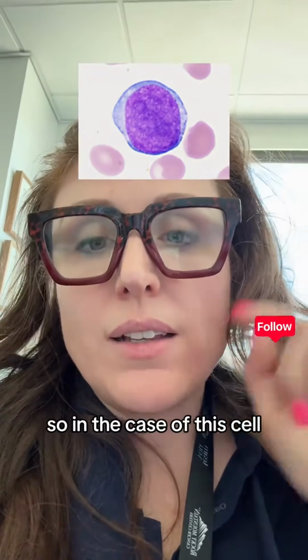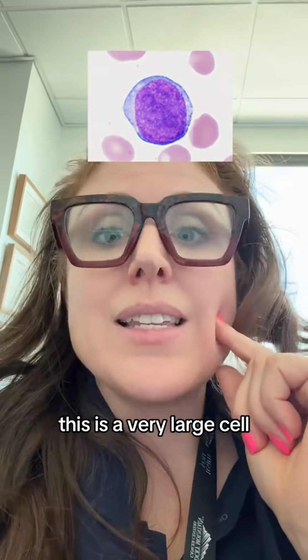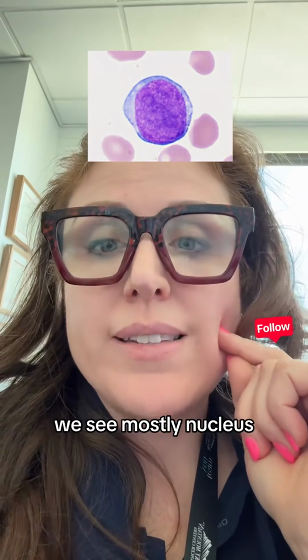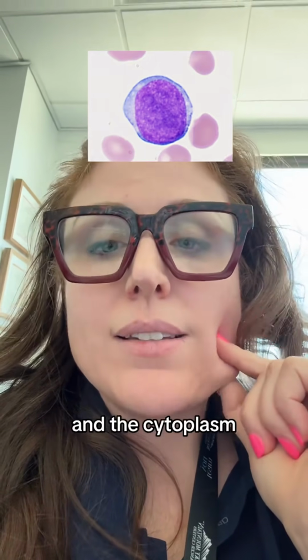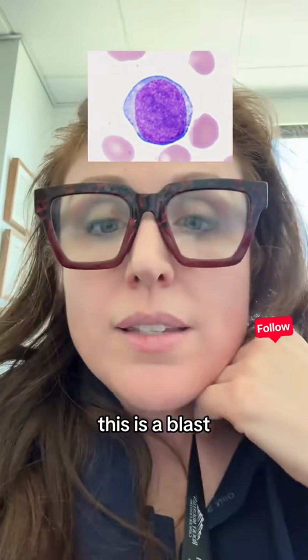So in the case of this cell, it is extremely large compared to the reference RBCs. You can fit 3, probably 4 red blood cells inside of this cell. This is a very large cell. The nucleus to cytoplasm ratio is very high. We see mostly nucleus. There are nucleoli. There's sort of open chromatin, and the cytoplasm, maybe there's a couple of little granules in there, but not too many. This is a blast.